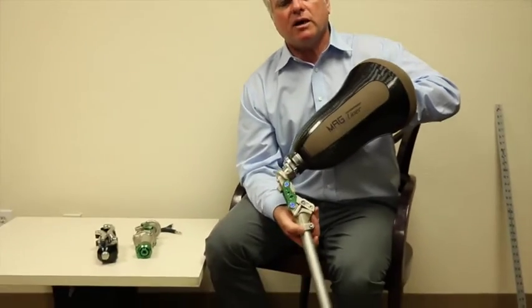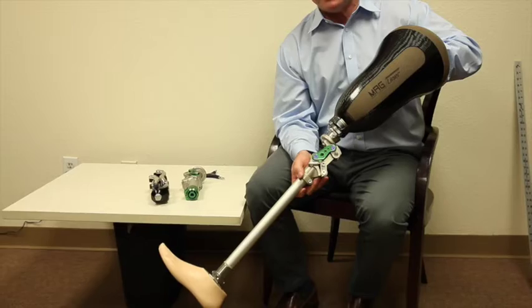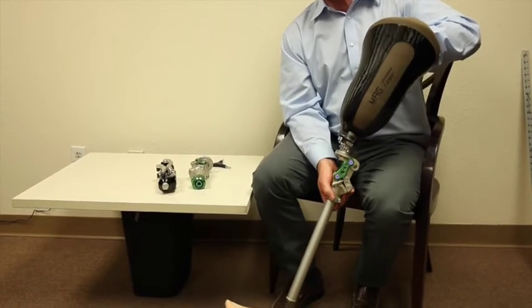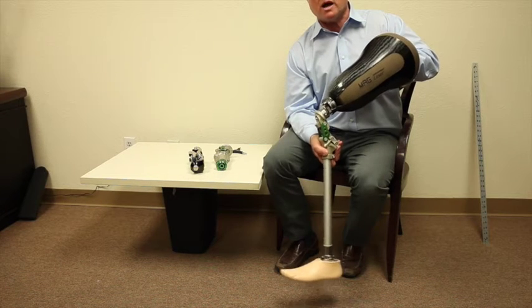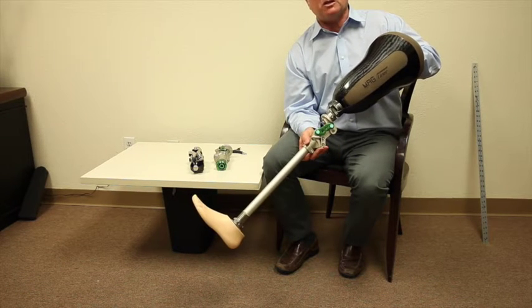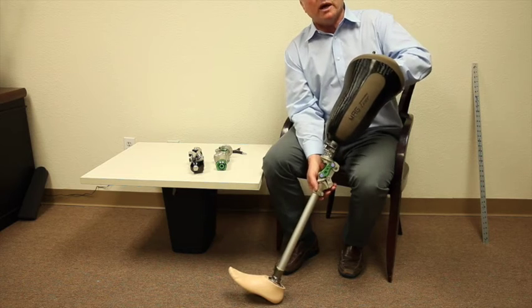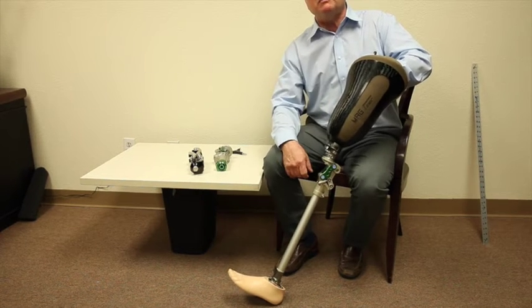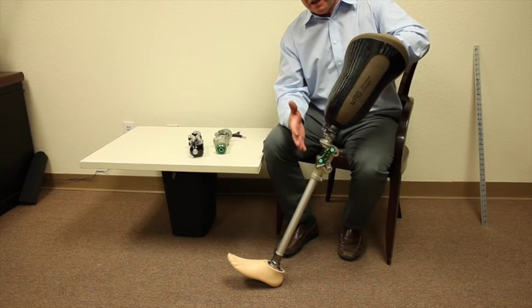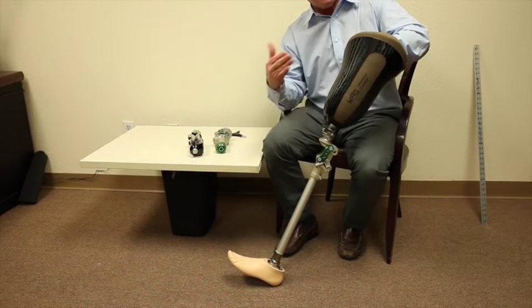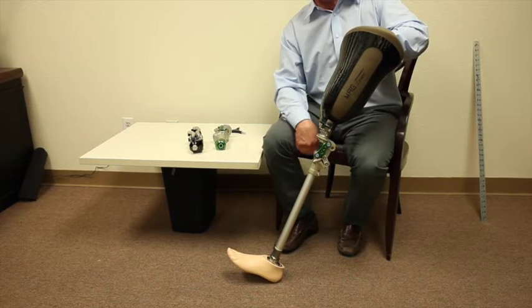When you get this knee, you're going to notice that it has a very smooth action. But it also has a terminal impact because this is not hydraulic nor pneumatic. And patients who are insecure in their walking like to know when they're in the safe mode before they apply weight. So we want to get a little bit of terminal impact just so they know where they're at, because this is being fit to a patient that's not a K3 yet.